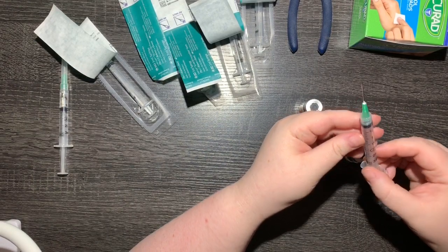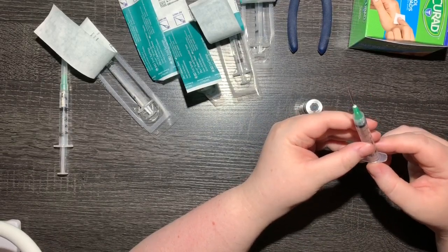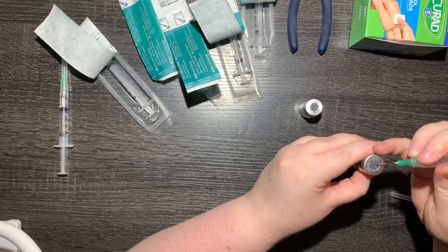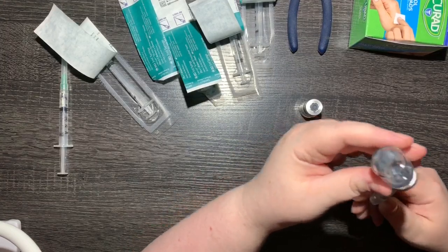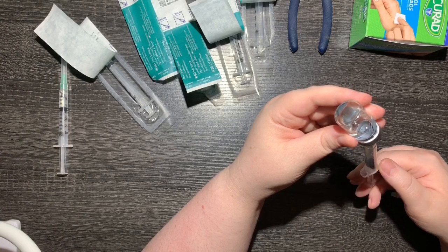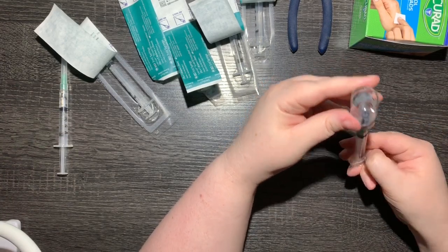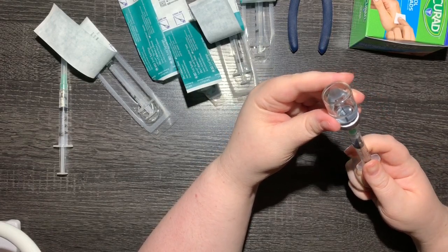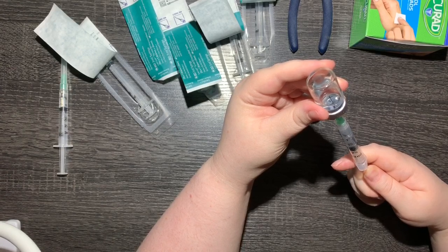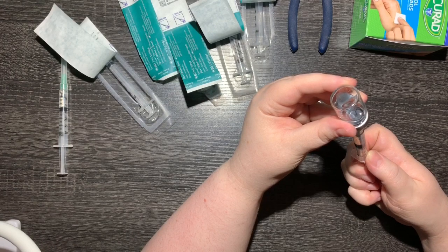The first thing I do with a new 21 gauge needle — this is something a pharmacist at one of my local pharmacies told me to do and I think it makes it a lot easier — I pull back the plunger all the way to the end. Then I take the bottle and go in at about a 45 degree angle all the way in. I turn the bottle so that the needle, since it's only one inch, is just a little bit above the fluid. Then I push the air back in without bubbling the fluid, then pull the needle down into the fluid.